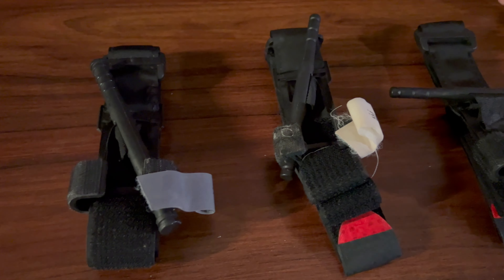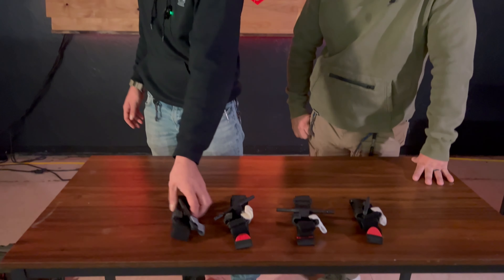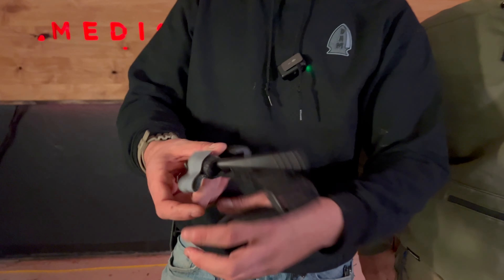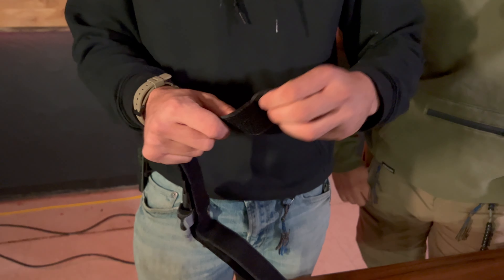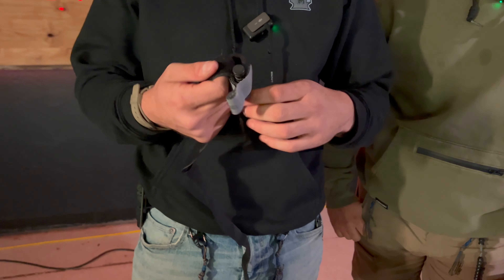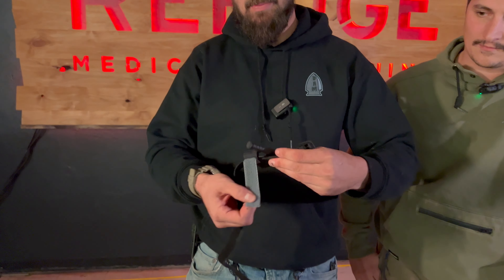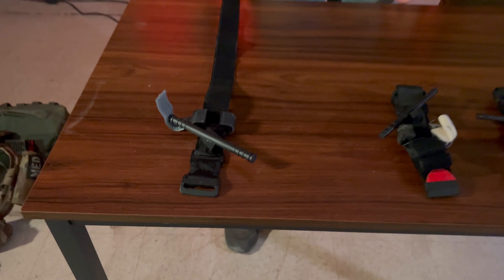A lot of people write in and say, 'Bob, there's a lot of counterfeit tourniquets on the market — how do you spot one?' Well, that's what we're here to talk to you about today. If you're out there slinging kits and tourniquets and want to know what is real and what is fake, here are a couple of things to look for.